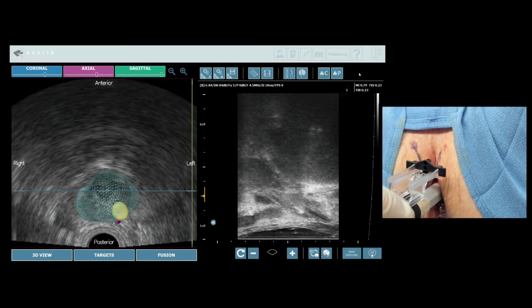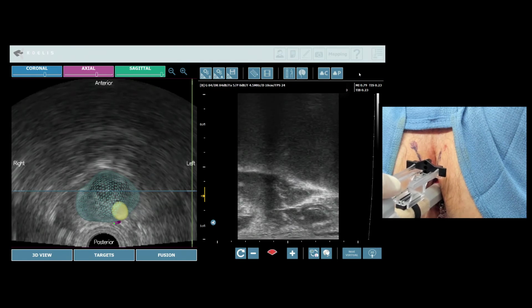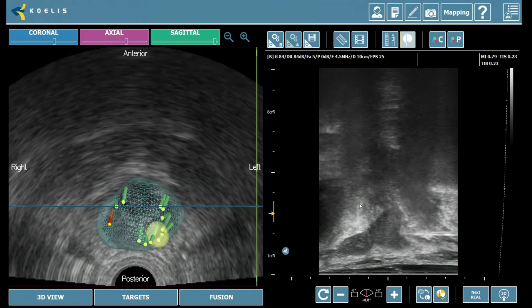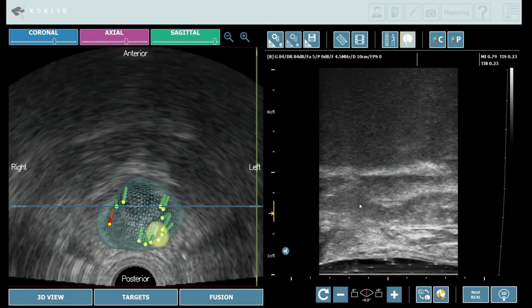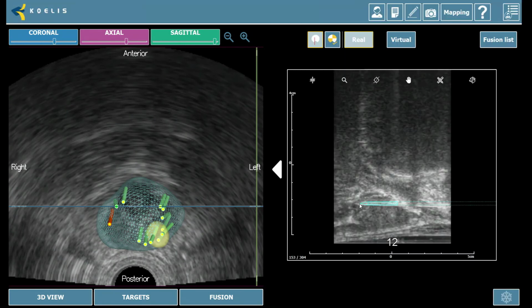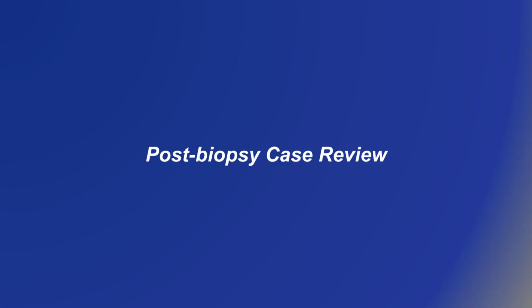Once the biopsy gun has been fired, the needle is left in place and an updated 3D ultrasound is acquired. The location of the real biopsy core is next recorded on the reference volume. These same steps are repeated for each throw of the needle, and as the procedure progresses, the location of each of the obtained biopsy specimens appears on the reference volume of the gland. This information allows the user to ensure adequate sampling of the gland with even spacing between cores.